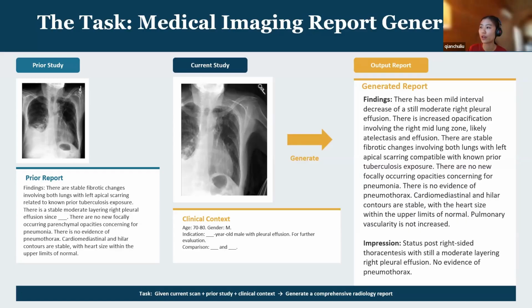Okay, so for our work, we want to train a model to follow a similar workflow as a radiologist, and we want the model to be able to generate a report that is closely aligned with the human reference report. So that is the task for context.